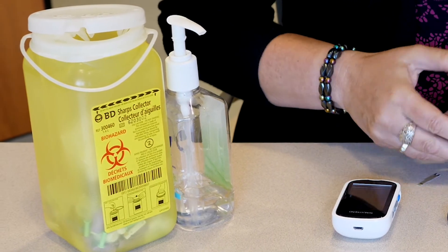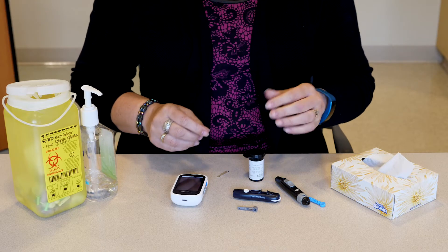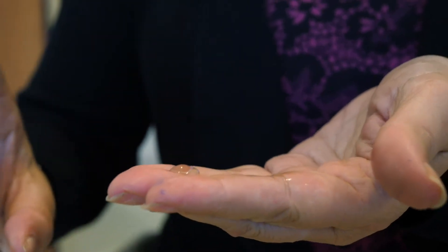The sharps container allows you to safely dispose of needles, as they should never be thrown in the trash. Before you test your blood sugar, wash your hands with soap and water or use hand sanitizer.